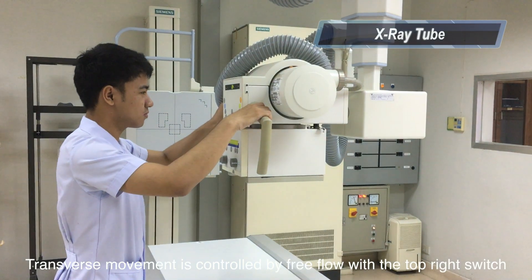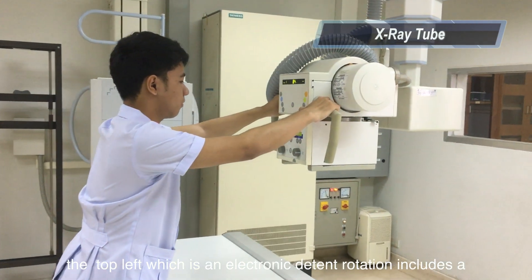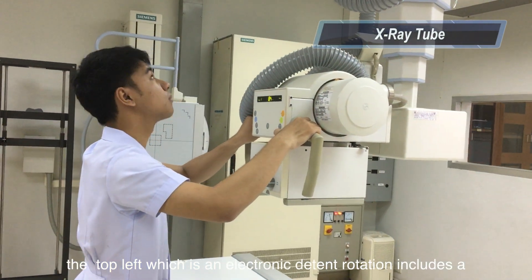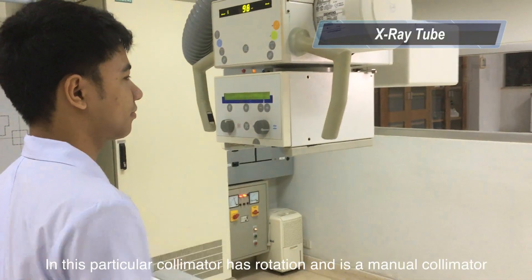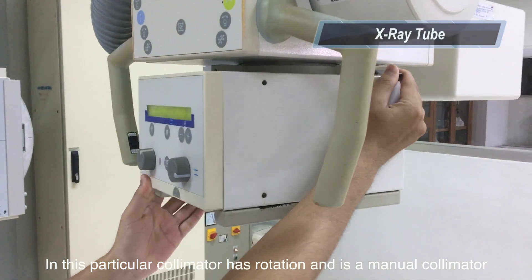The transverse movement is controlled by the top right switch. The top left switch enables electronic detent rotation, which includes 15, 30, and 45-degree manual detents. This particular collimator has rotation, and is a manual collimator.